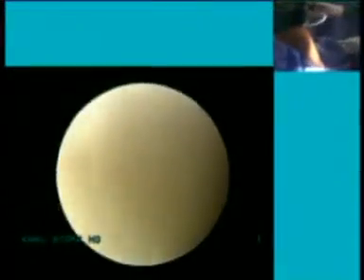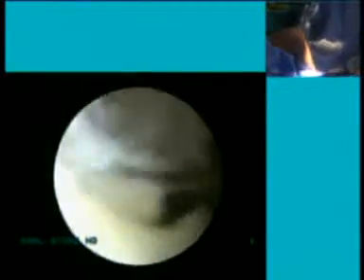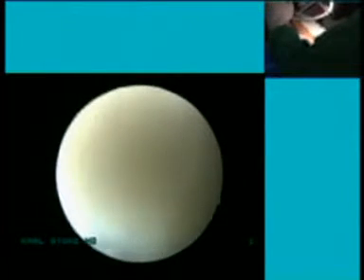How did you revise the femoral tunnel, sir? Since two holes are already there in the femur, did you do a medial portal, a transtibial, or an outside-in? You mean bone grafting? The revision of a double bundle, suppose... Yeah, that's what I say. The first stage is you clear the joint, so you do a bone grafting first. You do it in a staged manner. Yes, okay. Two staged manner.